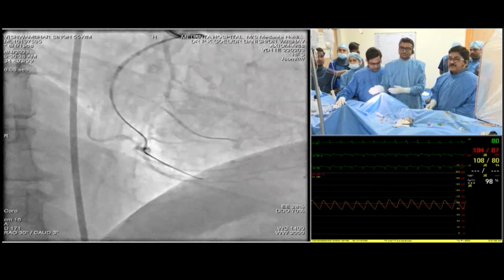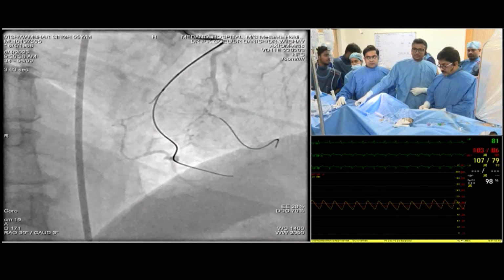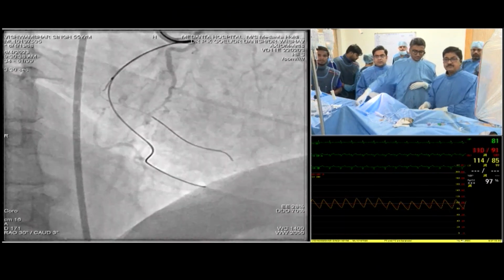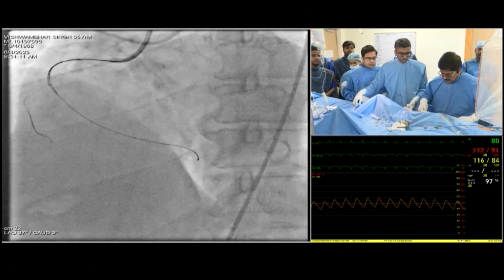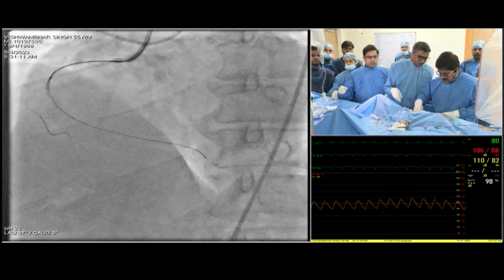Maybe due to the calcified lesion, I don't know where, but we cannot see deeper. And we have the chance, if we use a Nipro HD IVUS, we can see deeper and with good resolution. We have to think about which IVUS is better for this procedure.